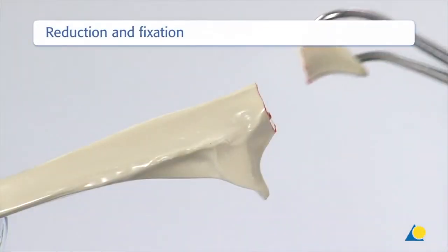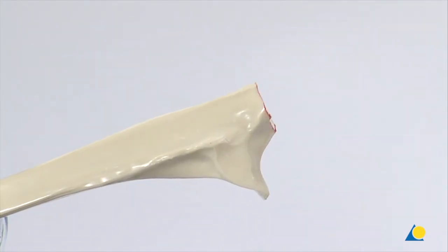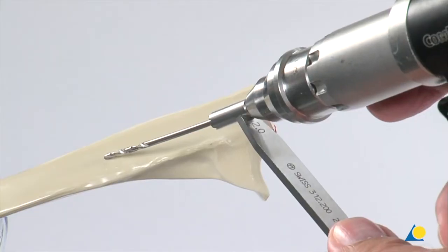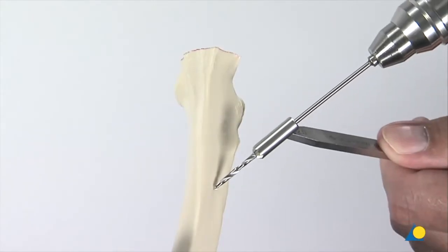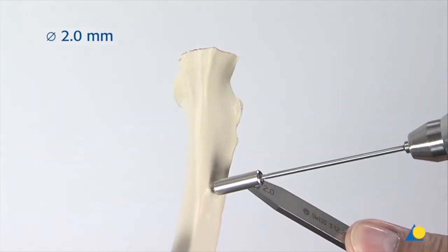The bone model has a transverse fracture of the olecranon. Approximately 4cm distal to the fracture line, a hole is drilled transversely through the ulna with the 2mm drill bit using a drill guide. The hole is positioned roughly in the center of the bone.